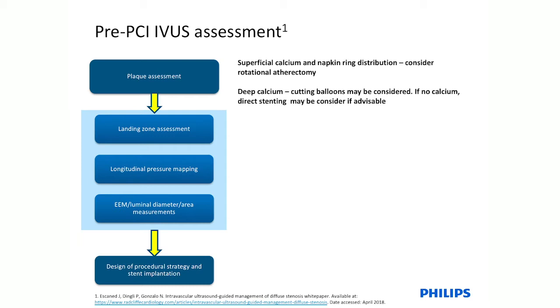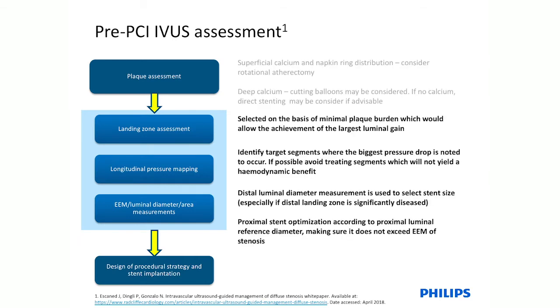The next thing you will have to do, sometimes, is to perform dilatation with a small balloon, a 2.0 balloon for example, and then perform IVUS again once you are able to advance the probe, to obtain the answers to very important questions. Basically, we are referring to the landing zone, where you plan to land with your stent, in order to anticipate the length of your stent. We're going to see this in detail in the next slide.